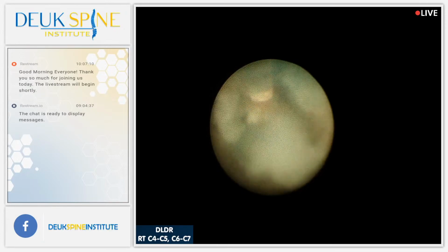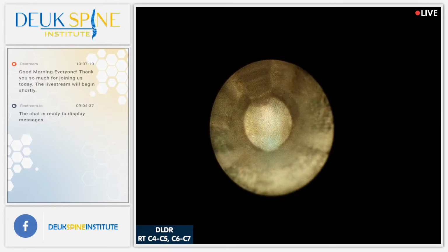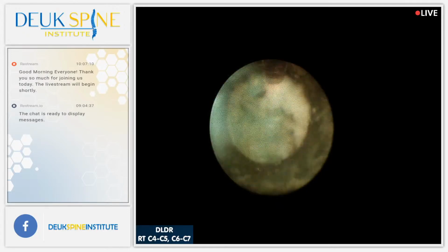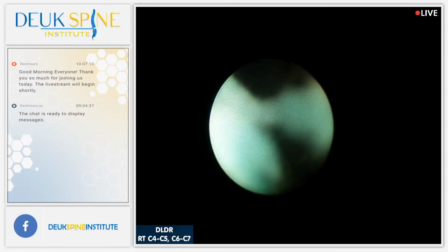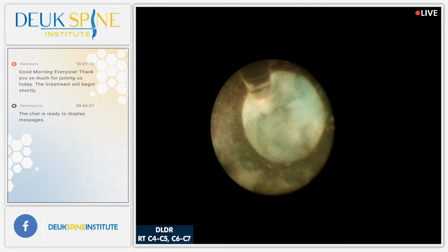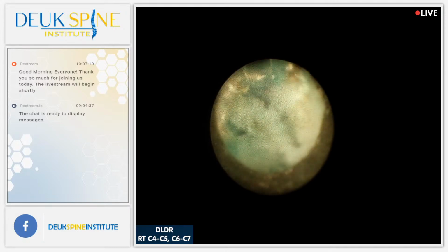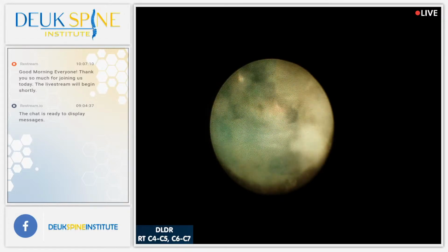Now, people think lasers are dangerous, but they're not. They're actually, like any tool, dangerous in the wrong hands. But a trained surgeon who is trained to do laser surgery on the spine, has experience doing laser surgery on the spine or brain, that kind of a surgeon can actually use the laser's full potential. The laser is an incredibly precise tool, more precise than any other surgical instrument we have. And the reason for that is the energy is emitted from the tip of this laser half of a millimeter, half of a millimeter out.